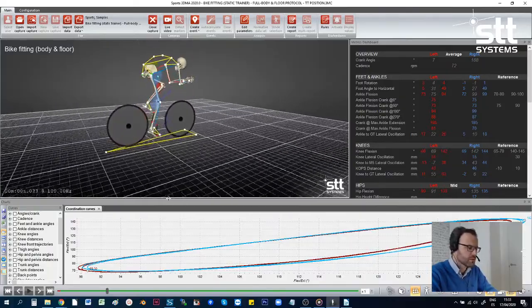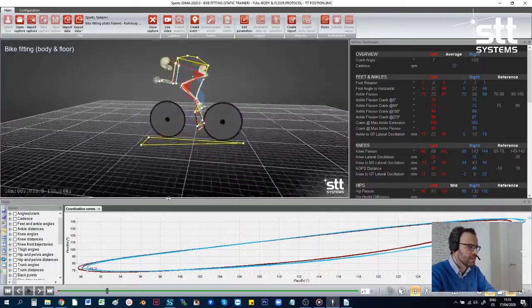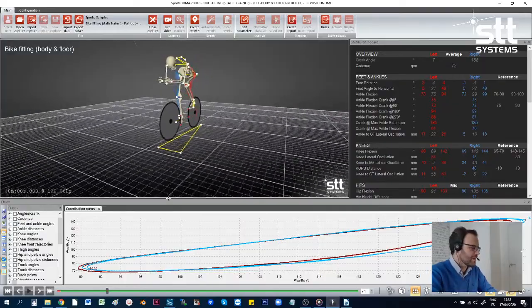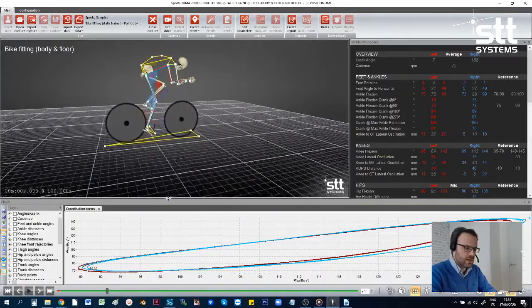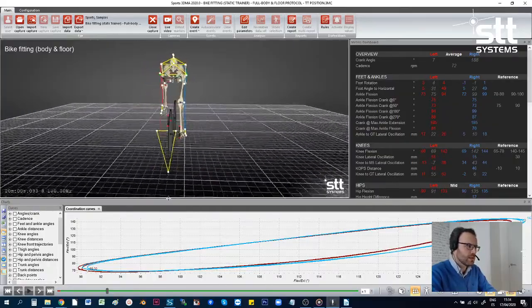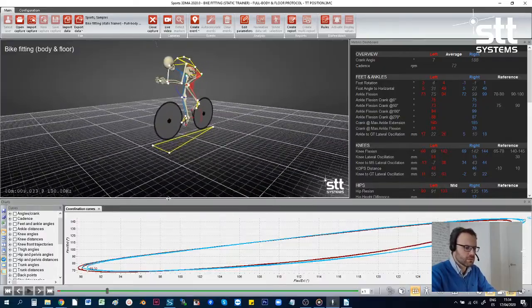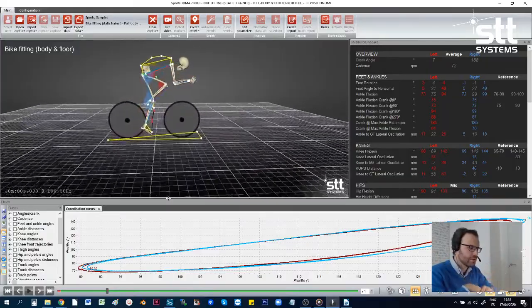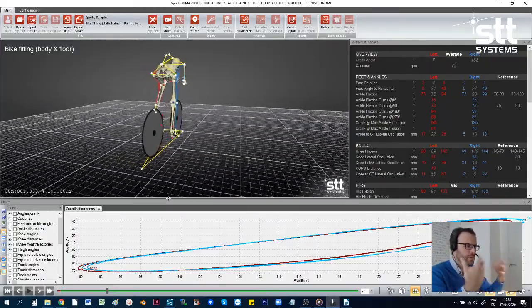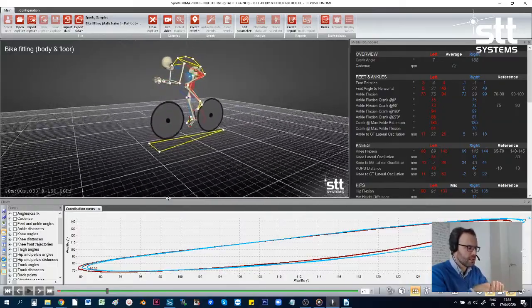For example, in terms of protocols, there are a few other protocols in the making. We're working on the kayaking and rowing protocol. We have ideas for a much more powerful full body analysis protocol, like an older, broader, or more powerful version than the standard 19 protocol.